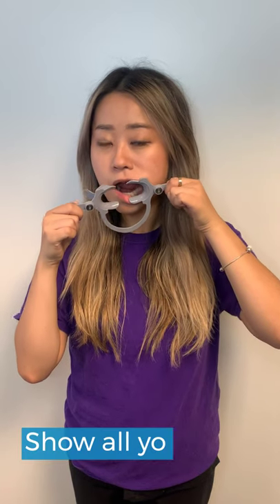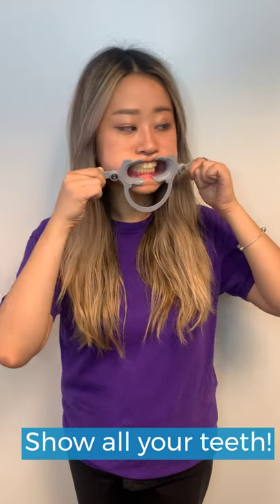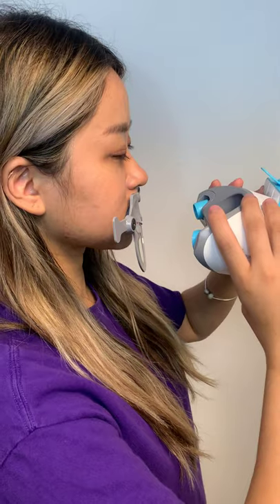Place the cheek retractor in your mouth so all your teeth are showing. Attach the scan box to the cheek retractors. You'll hear a snap when they're connected properly.